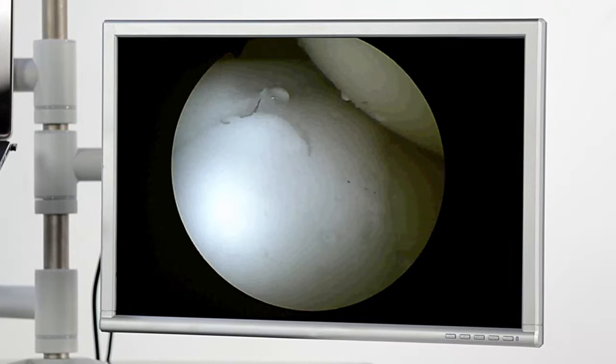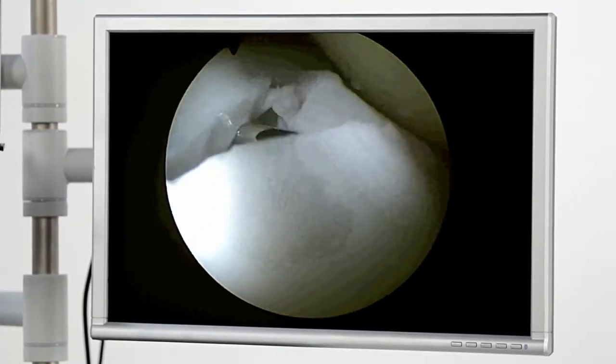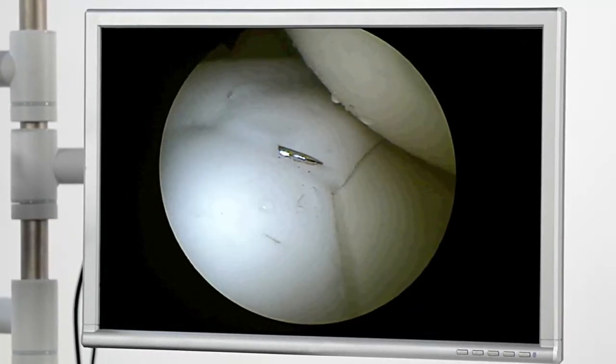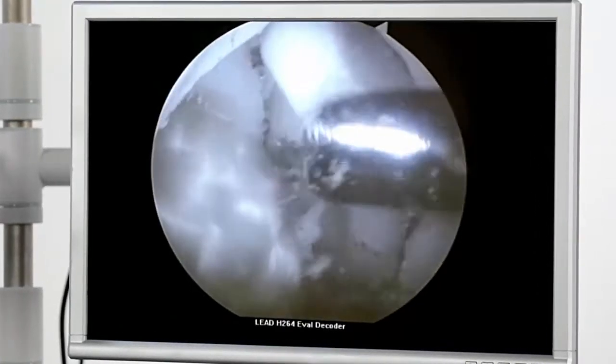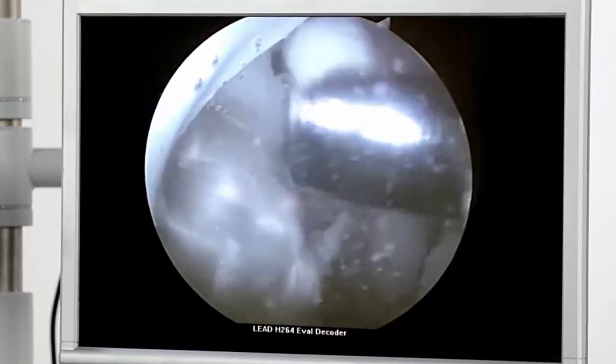In addition to resections, the simulator enables the reproduction of meniscus sutures, where the sections are attached with needle and surgical thread or darts. The liquid inside is like the fluid present in a real operation and allows the use of the shaver, including with cutting attachments.